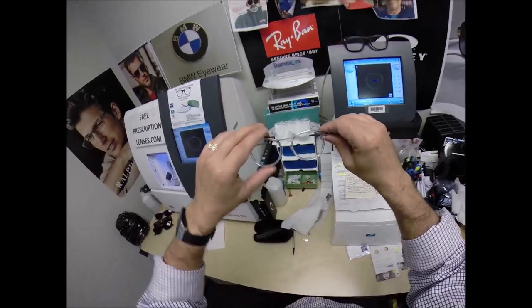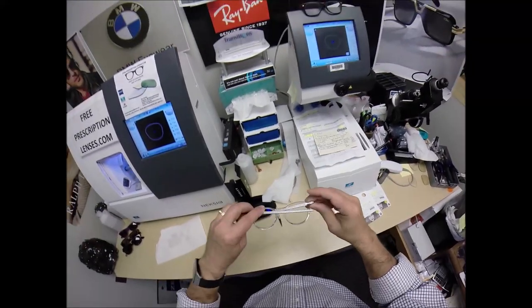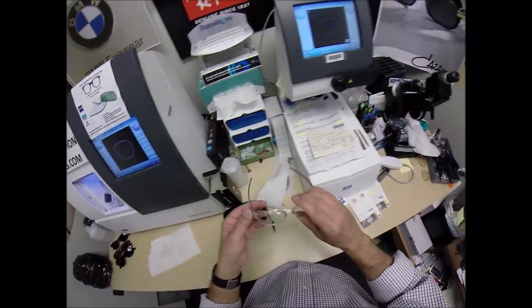But again, it only takes about 30 seconds to a minute to adjust a pair of glasses. So flip these over, press down, no wobble. When you get these in the mail, if they need any adjustments, just stop by your local place and tell them what's up. They will know what to do.